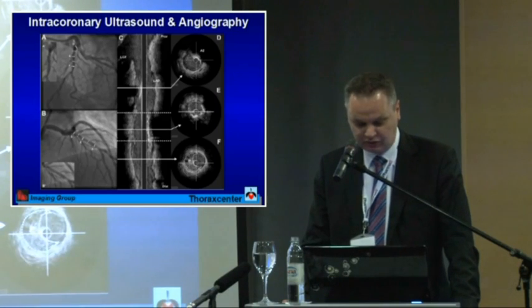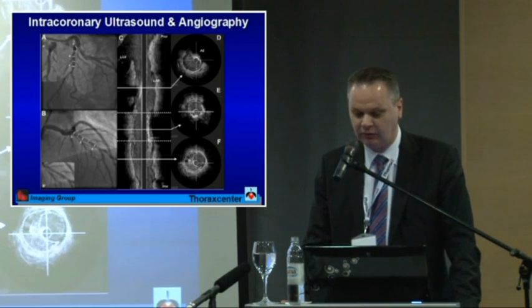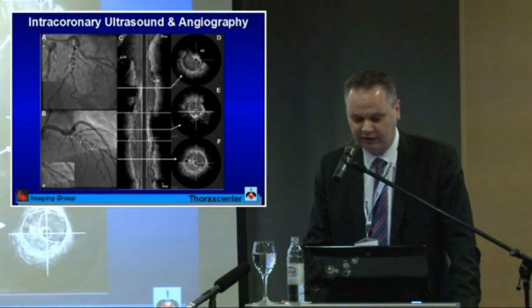Distal of the stent, which looks fine on the angiography, you see that there is still a large plaque burden. Actually, on all these 3 cross sections, you can see that the lumen is everywhere approximately the same.